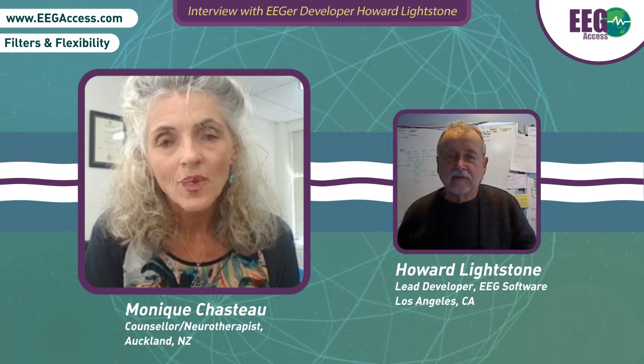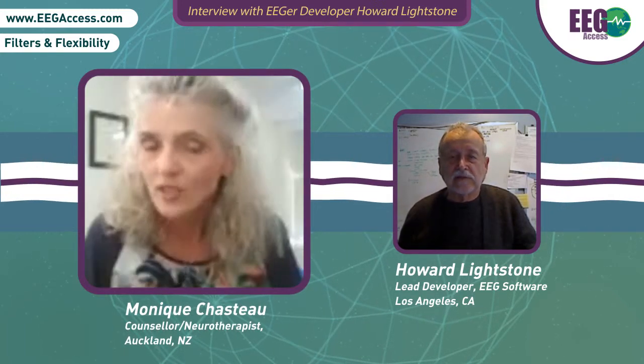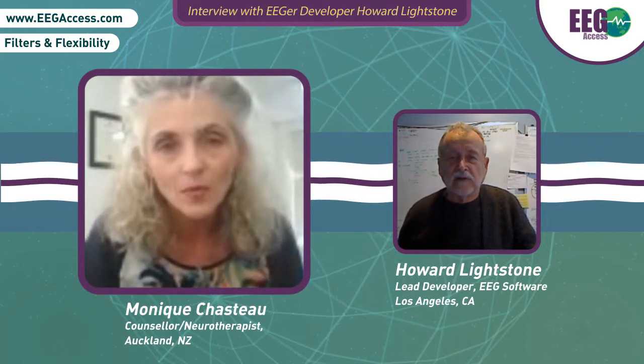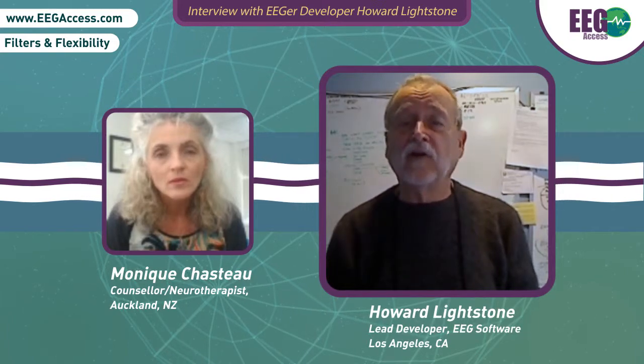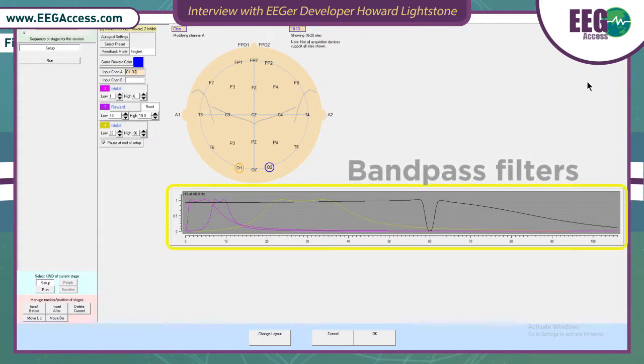That's a very useful metaphor for people to have. I'm wondering if you can expand on that even more, the idea of the proportional filter. Okay, so what I usually do is tell people, if you've got a copy of EEGer and you go to the plan session screen, that little graph down on the right-hand side shows the band pass limits for a particular band.